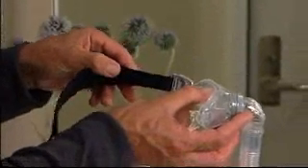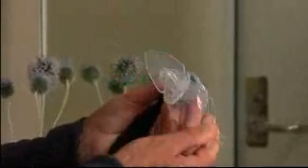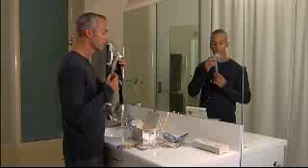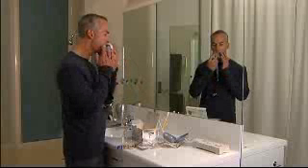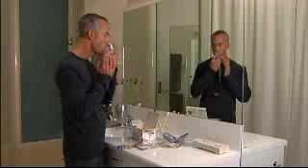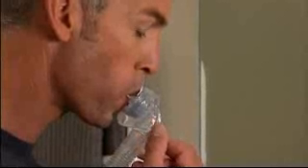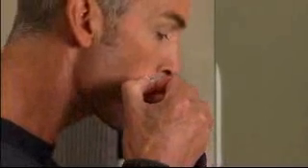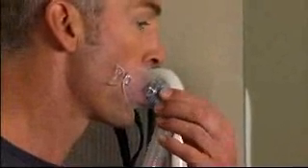Pull the snap flap cover back to the retracted position. Insert the soft seal into the mouth one side at a time, ensuring it sits in the gum region between the cheeks and the teeth. Move your lips around so they fit comfortably all the way over the soft seal. Return the snap flap cover back to its normal position to rest over the outside of the mouth.